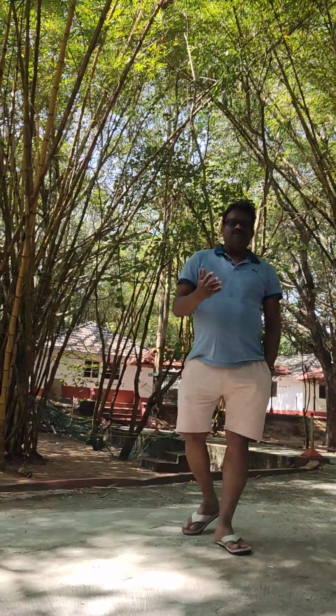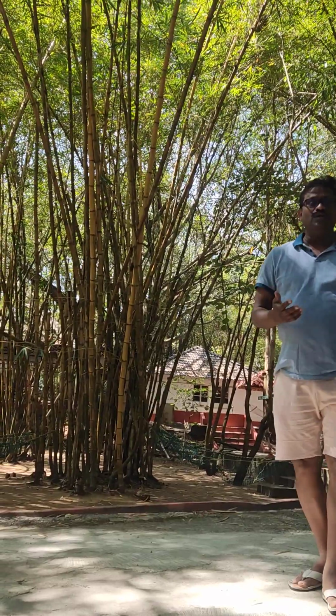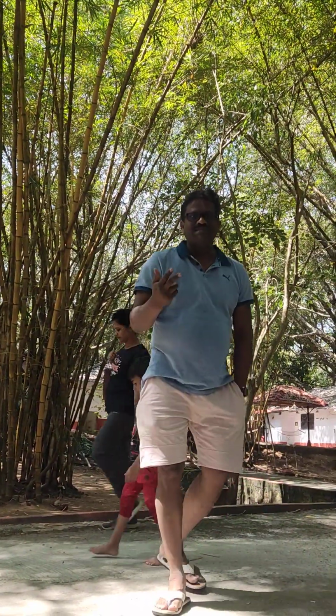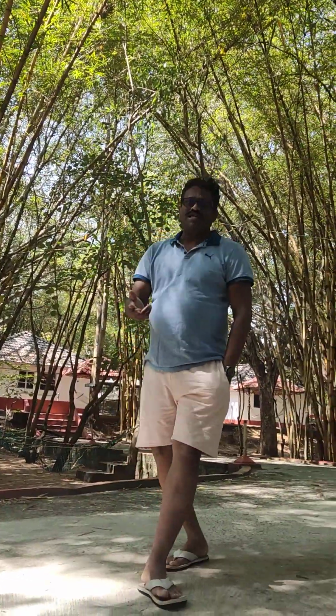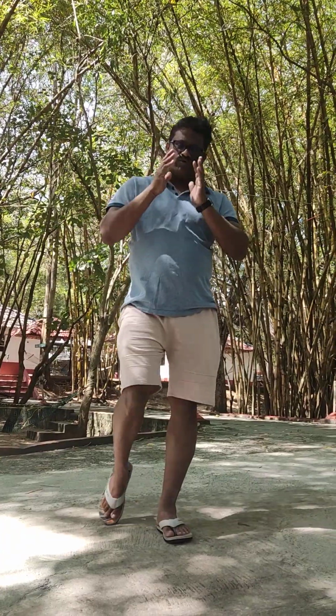I am more into full mouth rehabilitation cases as well as partially edentulous cases. In full mouth rehabilitation cases, I've used two types of basal implants. Basically, there are basal cortical screws as well as compressive screws. These are the main types of implants used in basal implantology for full mouth cases.